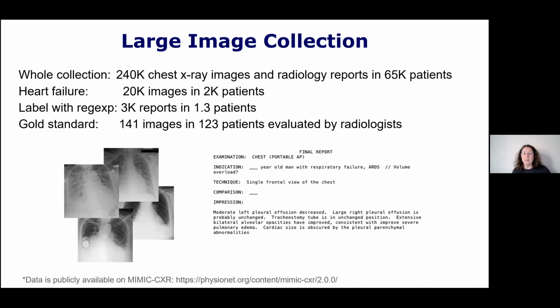Our work is grounded in a very large open source image data set called the MIMIC. So MIMIC is a much bigger database than just images. It's basically a database of physiological signals, images, radiology reports, doctor notes, everything there is to know about patients in emergency room and intensive care units at Beth Israel Deaconess Hospital that was created, curated, and released to the scientific community for research. So the numbers here give you a sense of the size of the data set and give you examples of images and radiology reports that we might have to work with.